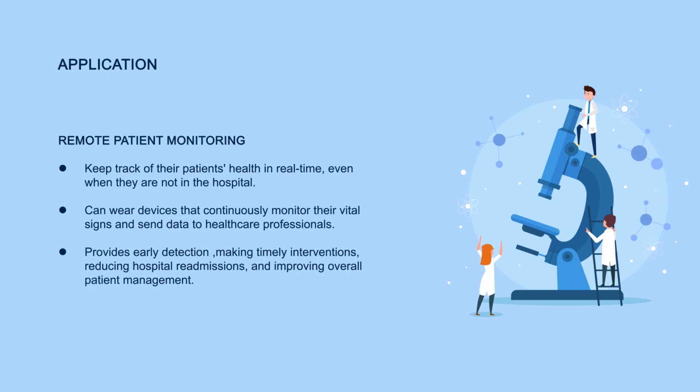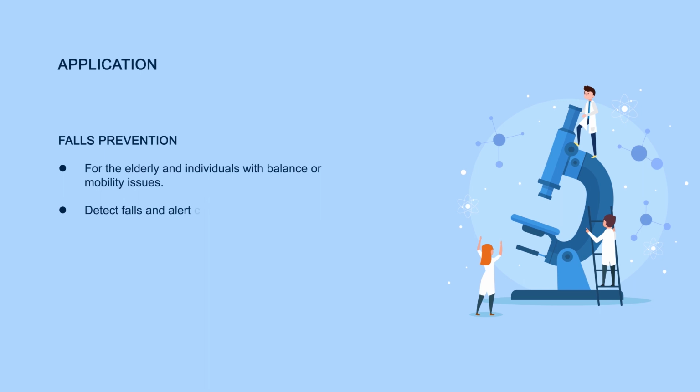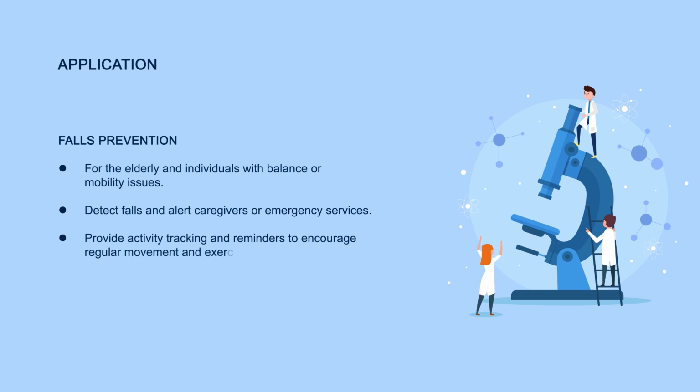improving overall patient management. The next one is fall detection, especially for the elderly and individuals with balance or mobility issues. Falls can be a significant concern. Wearable sensors can be incorporated into wearable devices like smartwatches or pendants to detect falls and alert caregivers or emergency services.